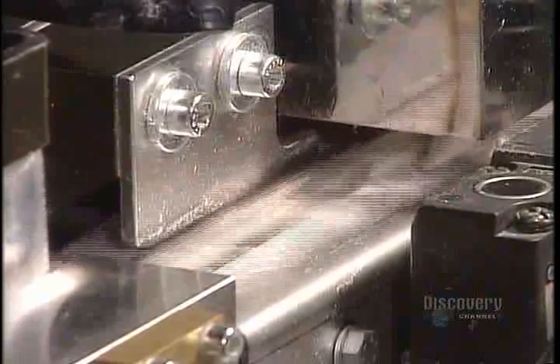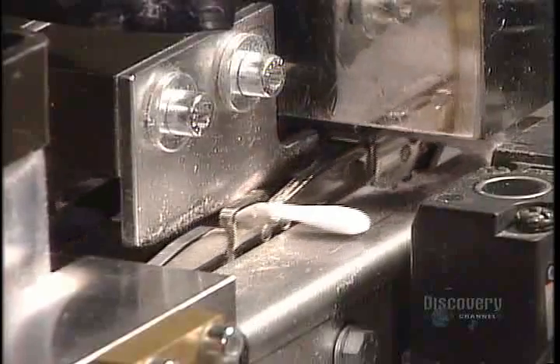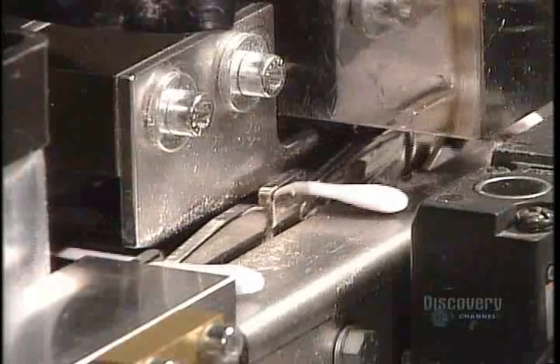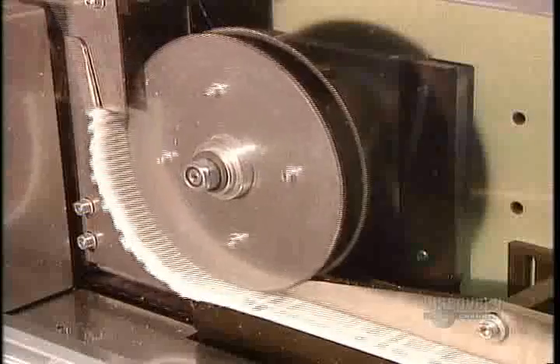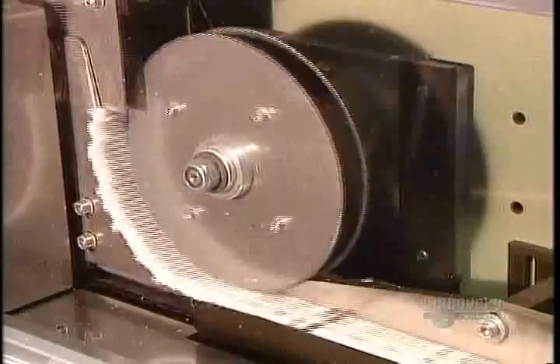The finished swabs are sprayed with an antibacterial solution. Here's that action in slow motion. And now, in real time, 2,000 swabs per minute. Sensors detect any defective swabs and automatically toss them off the production line. If you look closely, every so often you'll see one missing.